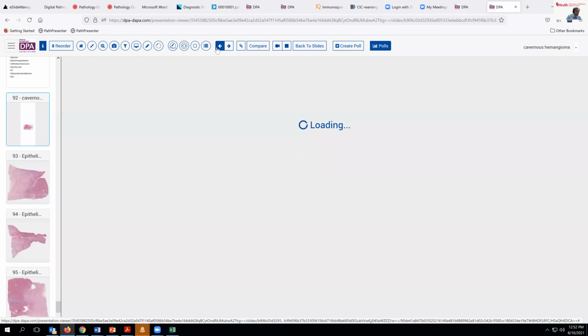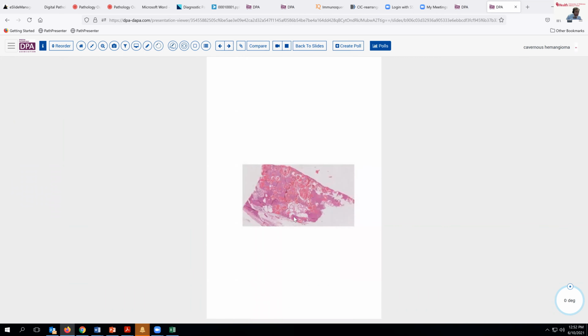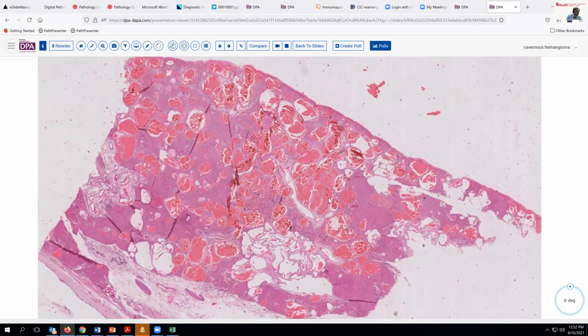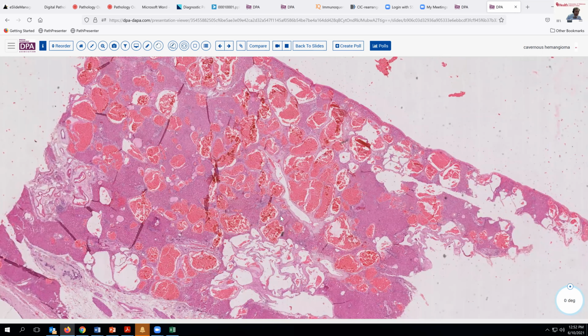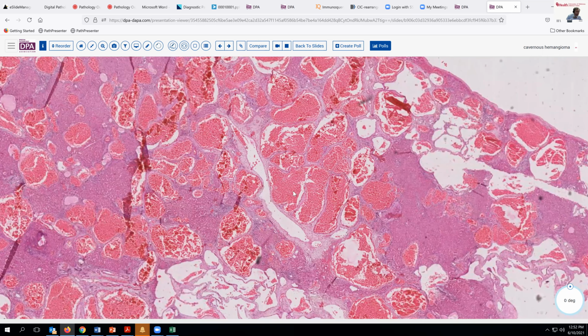of examples. So here first, certainly the most frequently encountered lesion in the liver is the hemangioma, and yet it's very infrequently biopsied because the radiologists are very good at recognizing it. This is what it looks like histologically, a nice cavernous appearance. These will have a different CT vascular phase appearance than other lesions. And you can see how nicely these dilated vessels are interspersed with normal hepatocyte lobules in between.